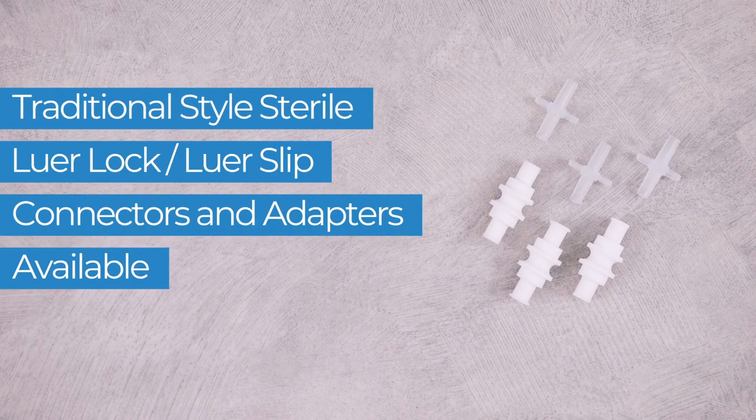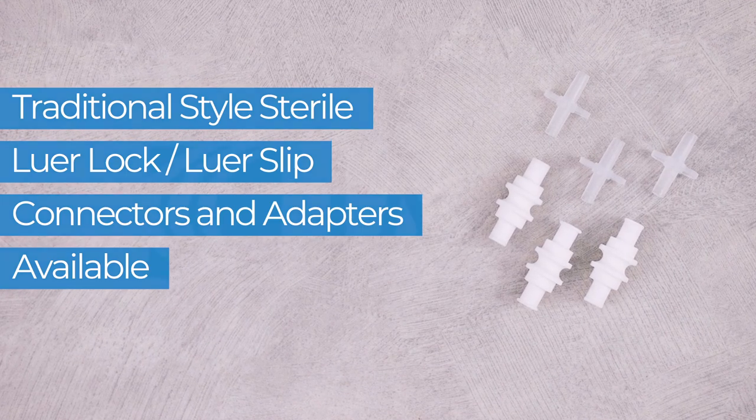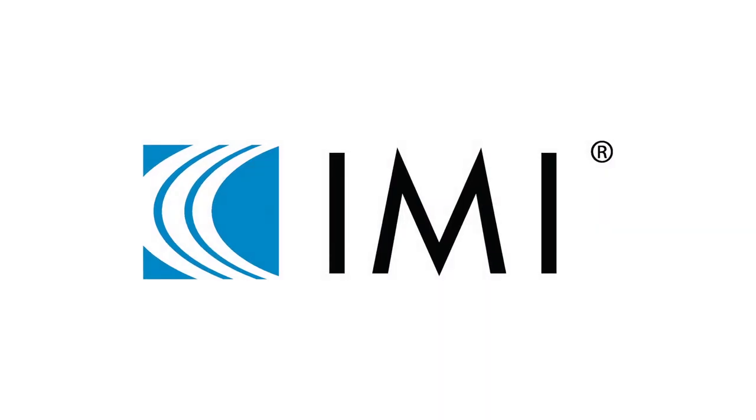IMI's PrepFill line of products also offers traditional style sterile Luer Lock and Luer Slip connectors and adapters.